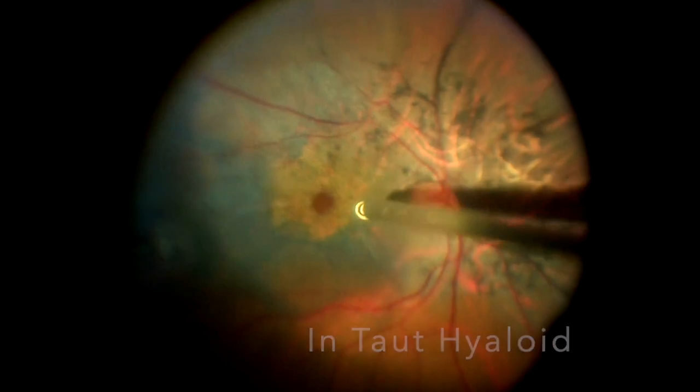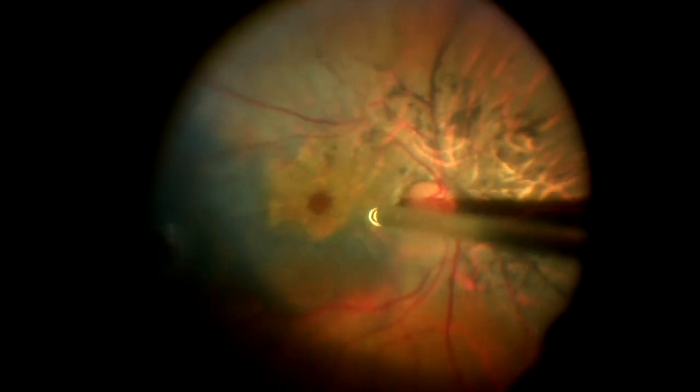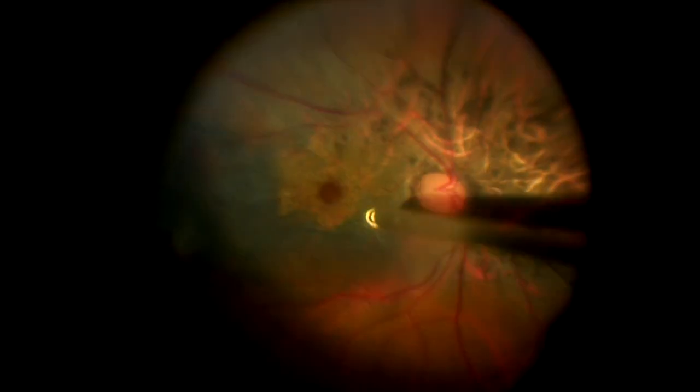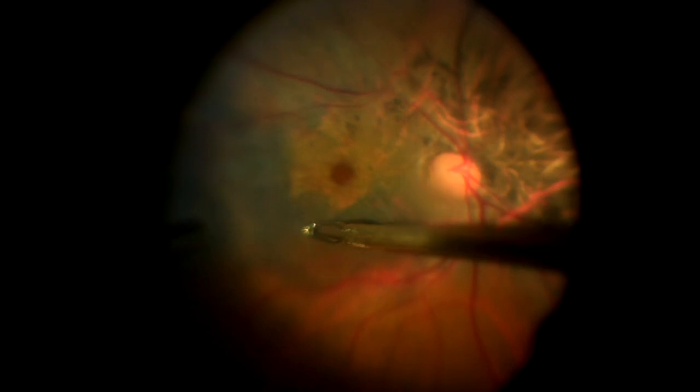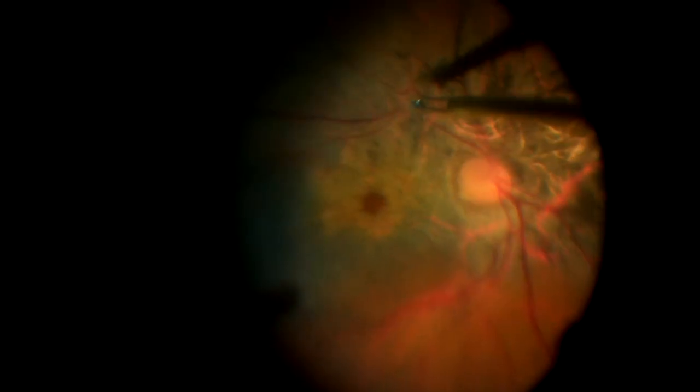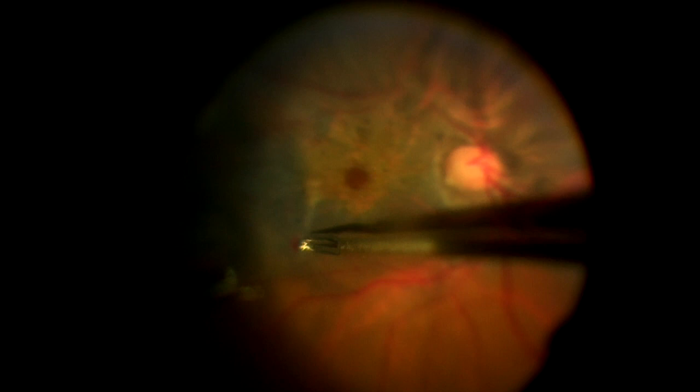In taut posterior hyaloid, here you can see the central part of the epiretinal membrane not taking up the brilliant blue stain. It's called negative staining. You can start peeling the ILM from a part where you can think that there is a cleavage. If you are seeing a cleavage, start peeling from that particular area. Always look for a cleavage or an area where there is a separation, and probably a preoperative OCT can also help us in that regard.